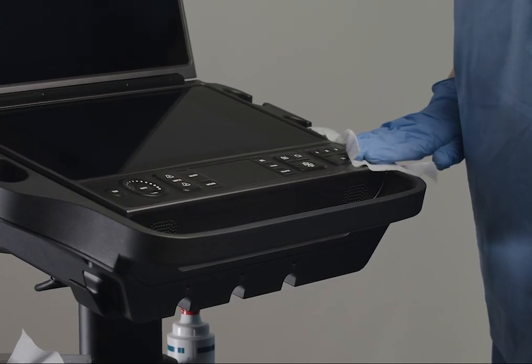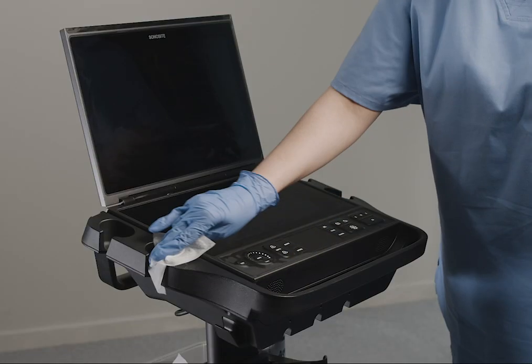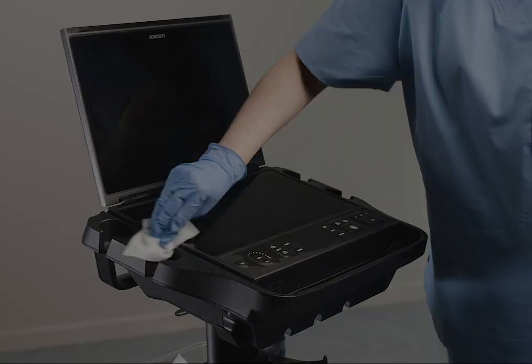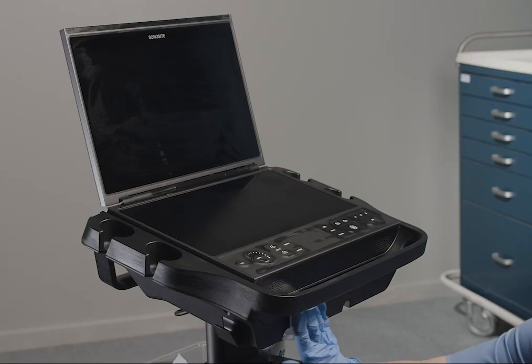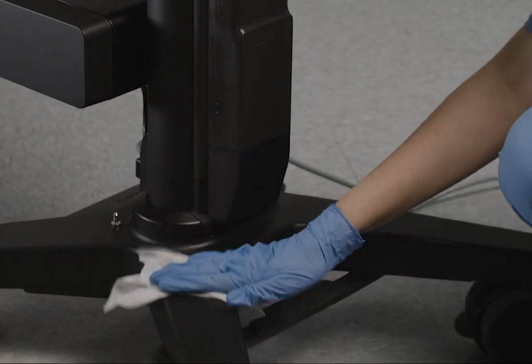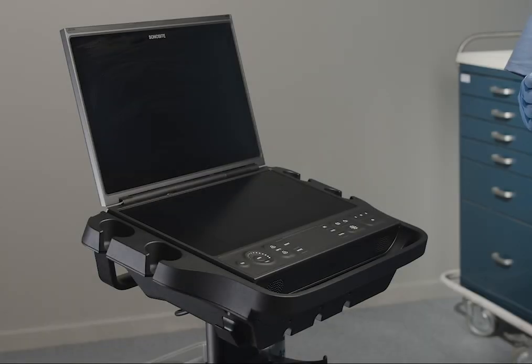Make sure the solution does not get into the connector ports. Using a pre-moistened wipe, clean the system and stand again. Allow the system to air dry following the chemical manufacturer's requirements for wet contact time.